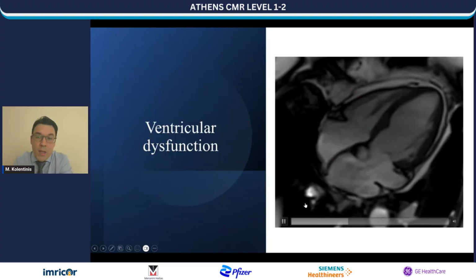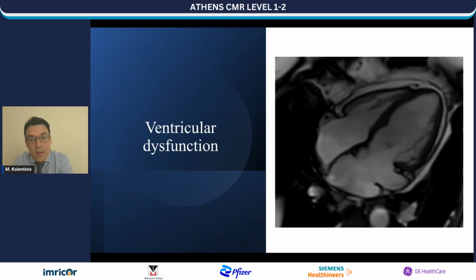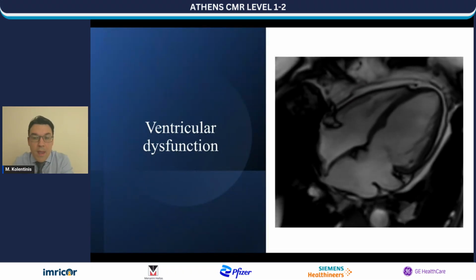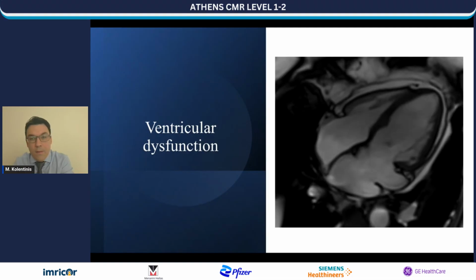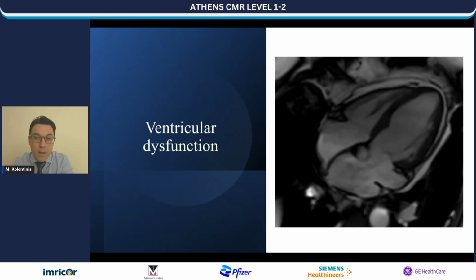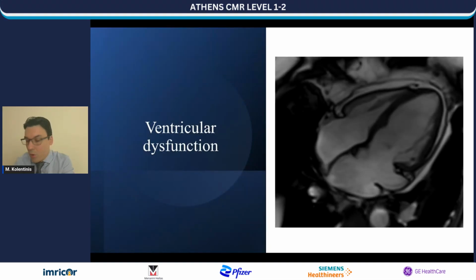Ventricular dysfunction. This patient has mitral regurgitation. The echo showed normal left ventricular ejection fraction, but when we performed MR, it showed that ejection fraction was somewhat depressed.